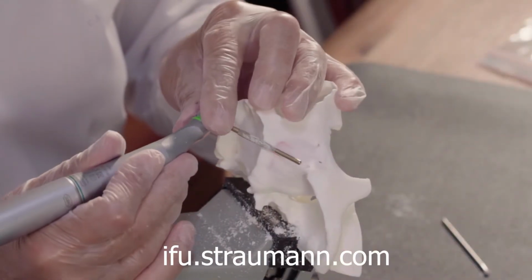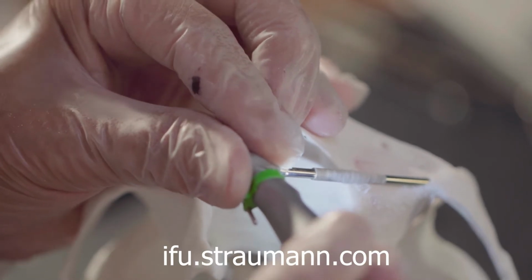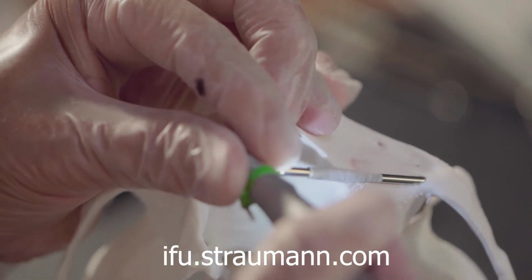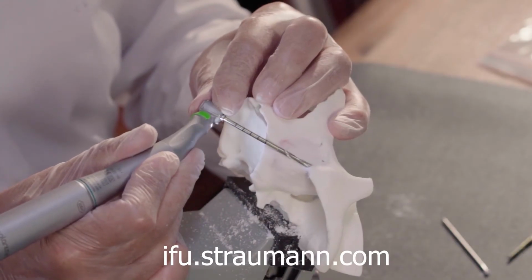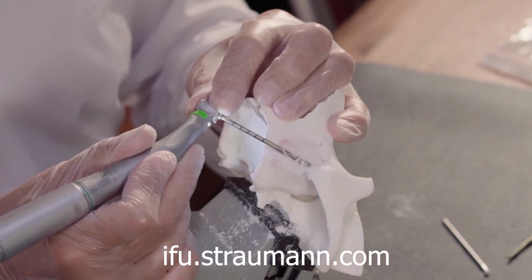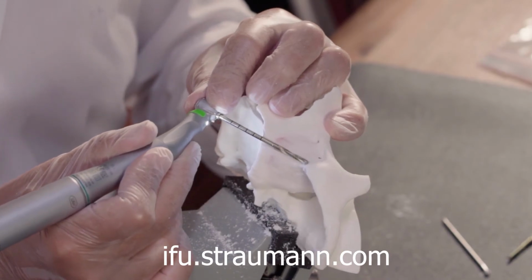So now I can enlarge a little bit more using this lateral cutting bar. No danger now to perforate. So we have a very smooth path for this drill, for the 2.9 drill. So 1, 2, 3, 4, out and irrigation. 1, 2, 3, 4, out and irrigation.